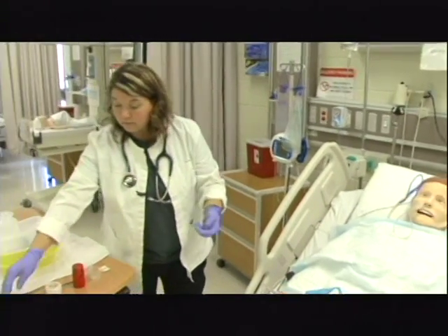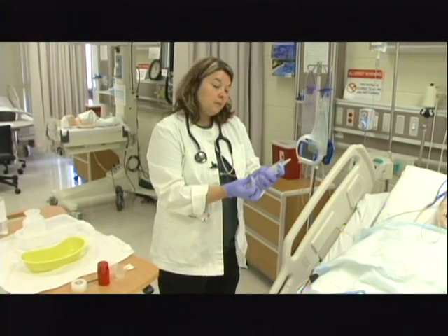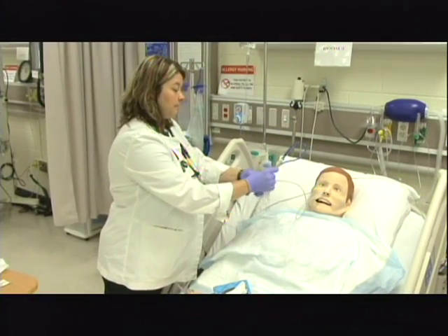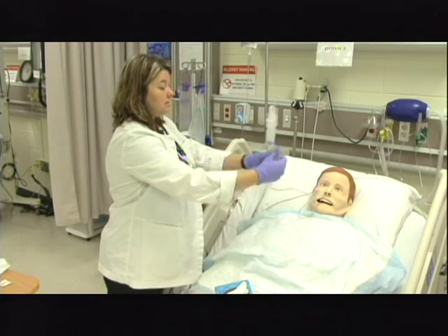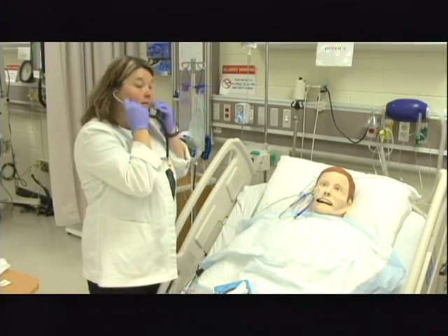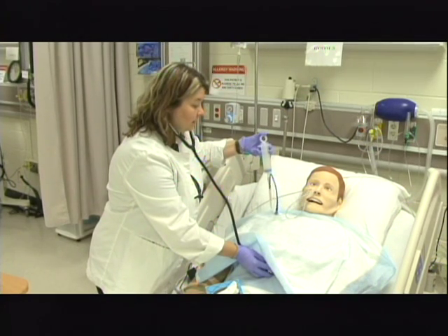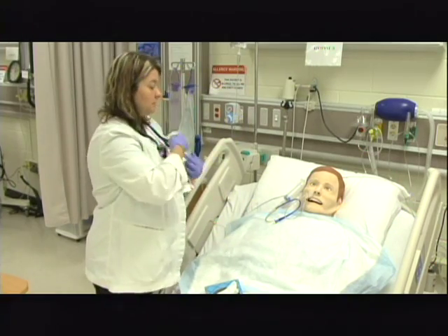I'm going to come back over here, and now I'm going to pull up 5 to 10 milliliters of air in my piston syringe. I'm going to clamp the tube, take the anti-reflux valve out and attach the actual piston irrigation syringe. I'm going to put my stethoscope back in. I'm then going to listen over the patient's epigastric area while I inject the air and listen for the whoosh. I can now take my stethoscope back out.